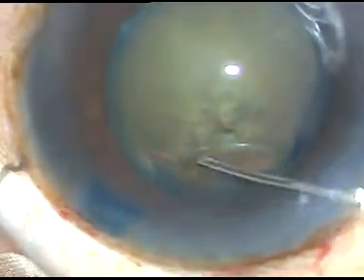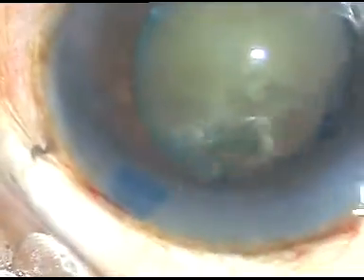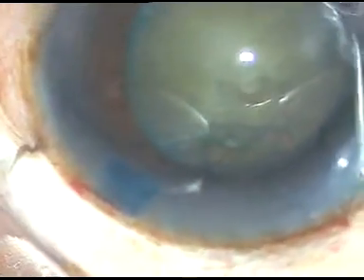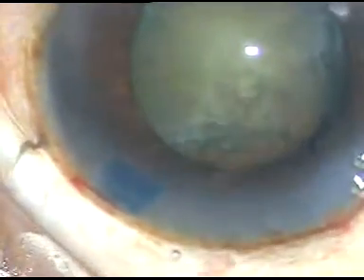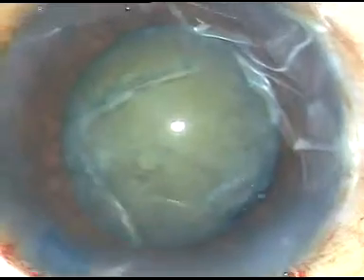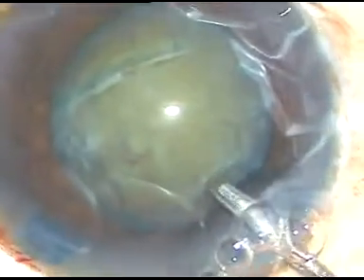Now this is hydrodissection. Fluid is passed just underneath the anterior capsular rim. The nucleus is depressed and it is made free from the capsule by rotating it. And now is the time to enter into the eye with the tip of the Phaco handpiece, and in this case I am going to do direct chop.